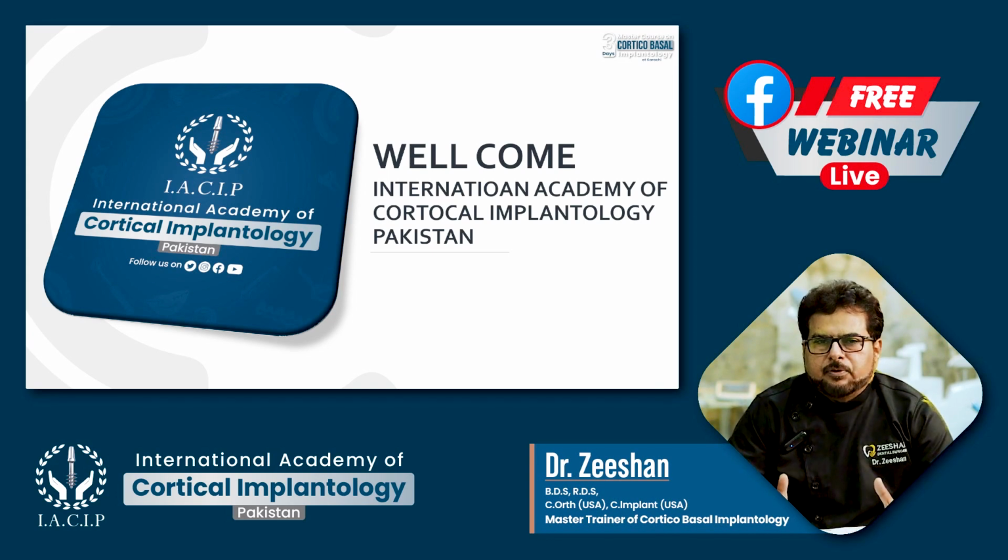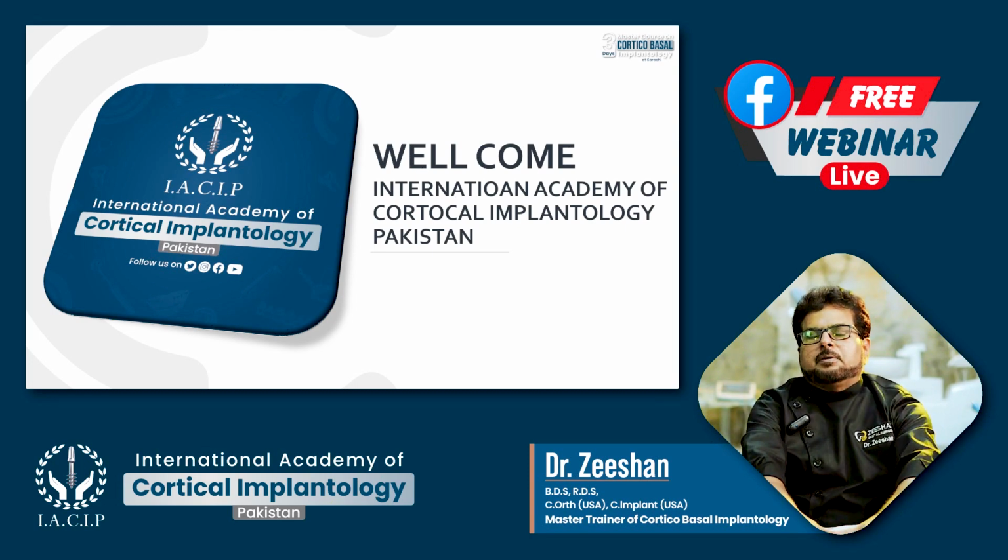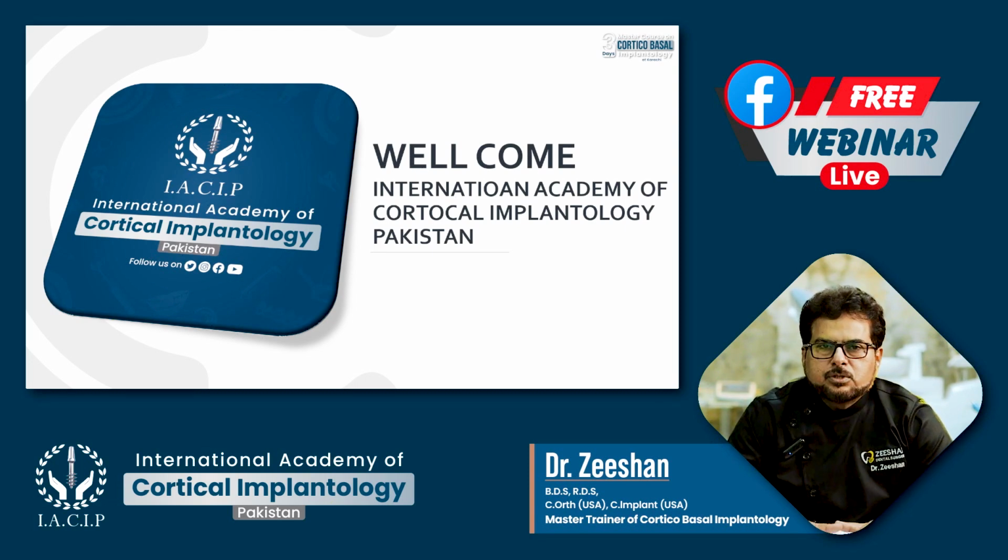Even then, if you prefer the conventional implant angle with angular abutment, you can choose, but to choose that implant you need bone, depth of the bone, which is not available in your case. So selecting a patient for immediate loading means you need bone, and you don't have bone in your patient. So you have to select a system which can provide you the basics for immediate loading.